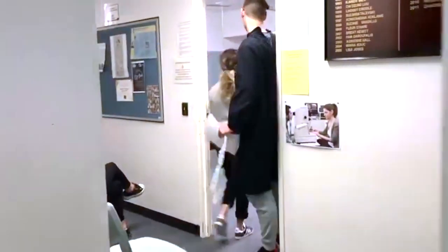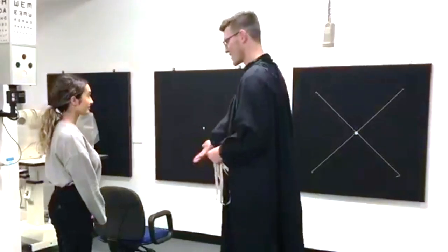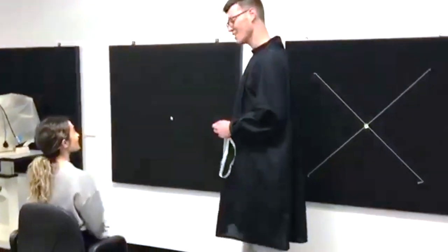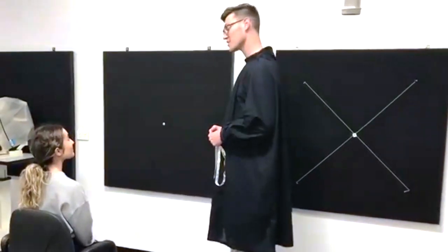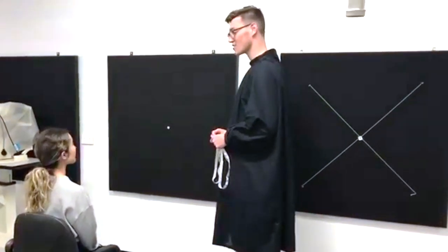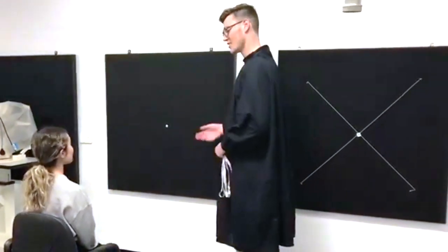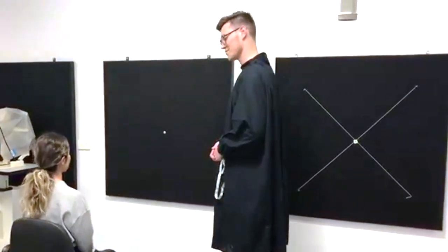Now let's watch an orthoptist perform a Bjerrum consultation. The orthoptist introduces herself as Jordan and explains to the patient that they will be performing a visual field test, which measures how far they can see to the sides and up and down while looking straight ahead using the Bjerrum.